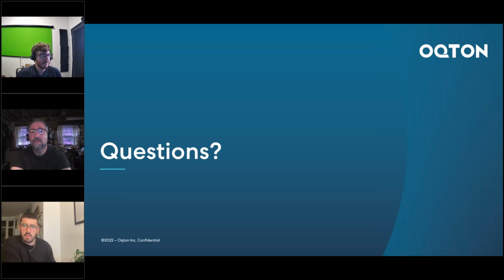Great. We have one here. It looks like someone wants to learn more about the automation workflows that you showed. Have we got any tutorials available for Freeform to learn how to use the Dynabot? Inside Freeform's documentation folder, we do have a Dynabot training manual and user's guide, as well as a large collection of example scripts.